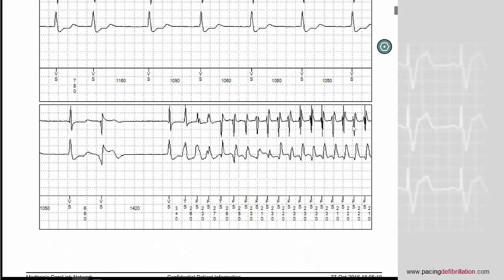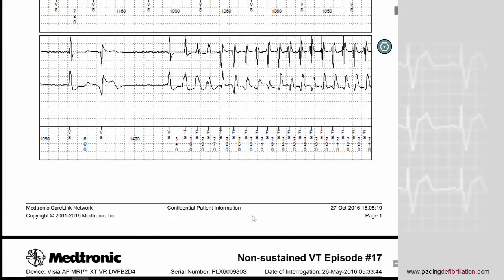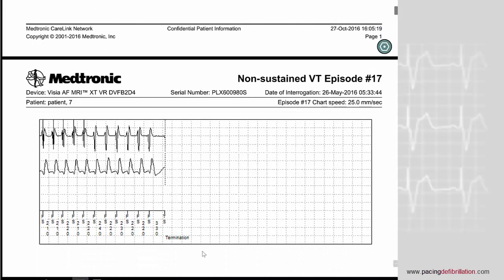If you look at the EGM, you can see that there is a real ventricular tachycardia — a very fast tachycardia. You can see the fast cycles at 210-230 bpm, and then after 28 cycles, there is a spontaneous termination.